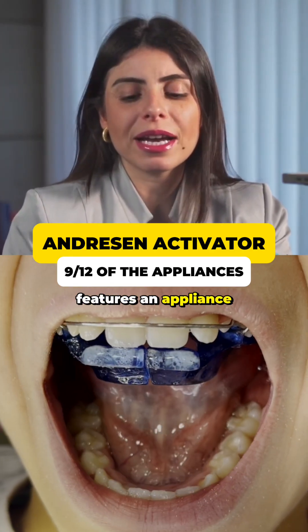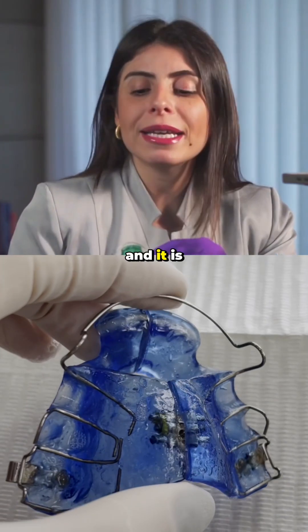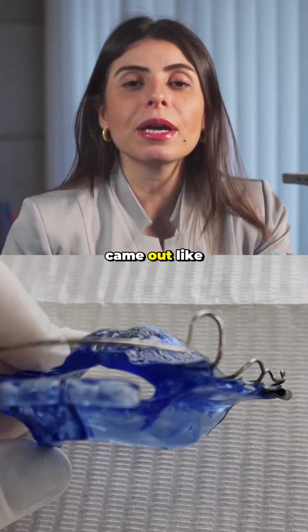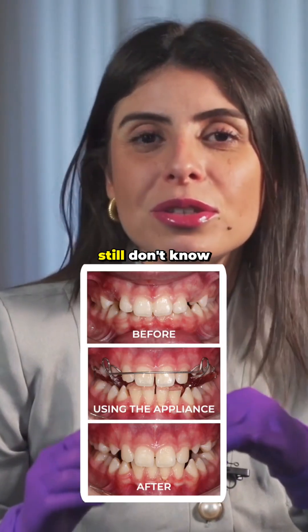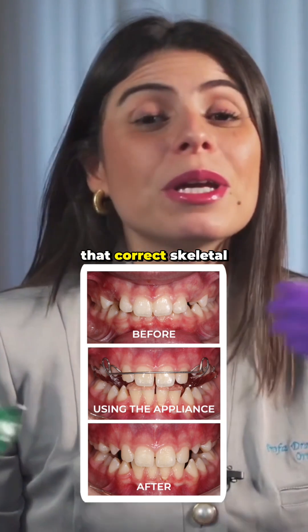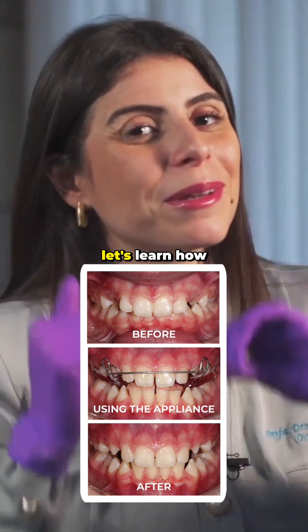Episode 9 features an appliance that is one of the most used in the world for the treatment of Class 2. After this appliance, many others came out, like the Bionator. If you still don't know the Andresen Activator, it would be the father of all other appliances that correct skeletal Class 2 due to mandibular deficiency. Let's learn how the Andresen Activator works.